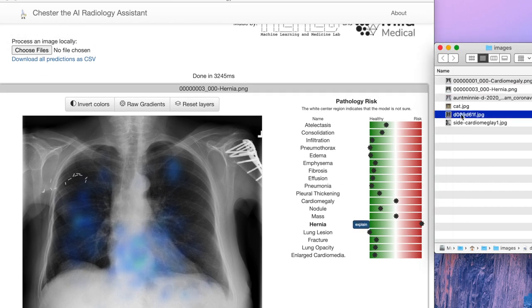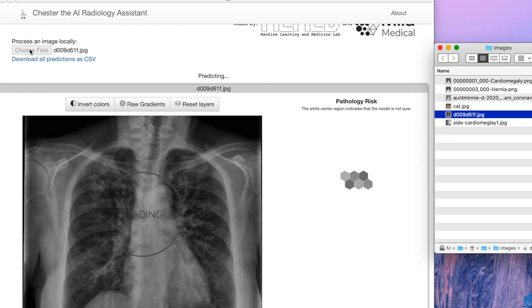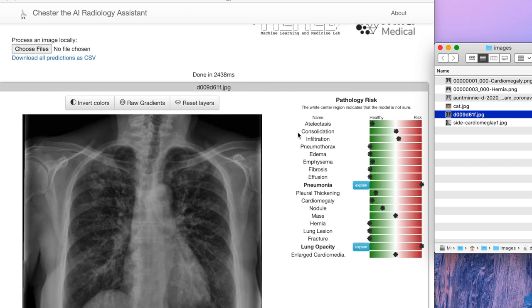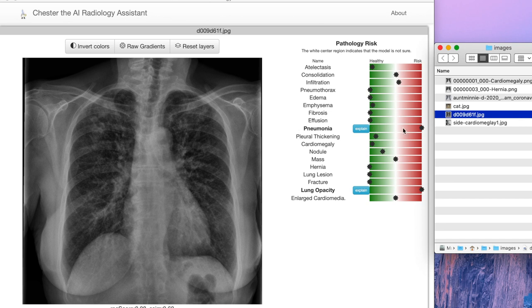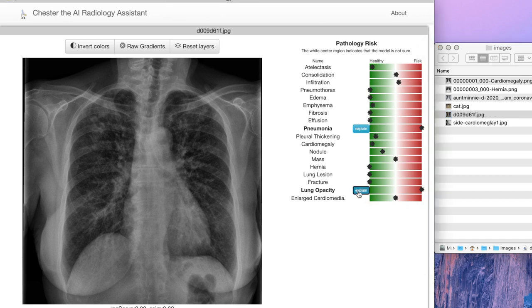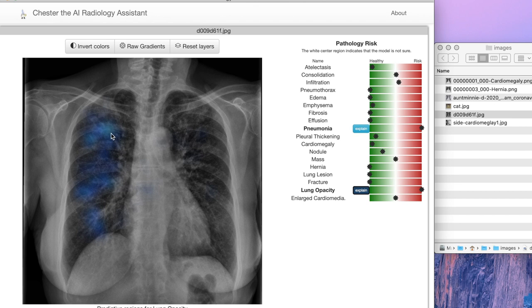We can also take a look at another person with pneumonia. We see two large predictions — one for pneumonia and one for lung opacity. We can click explain on lung opacity, and we can see that the saliency map appears just for one side of the image. This is demonstrating that the model has the ability to highlight just one lung as the cause of that prediction.